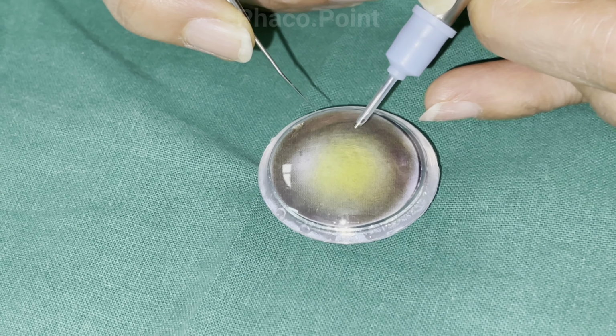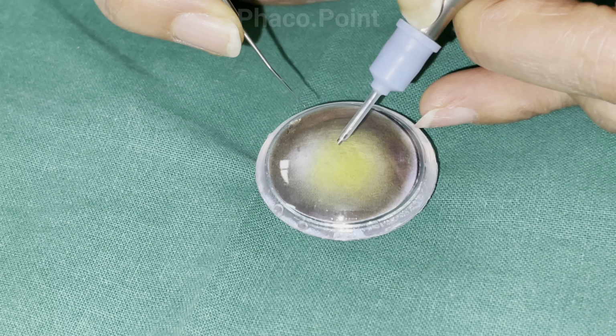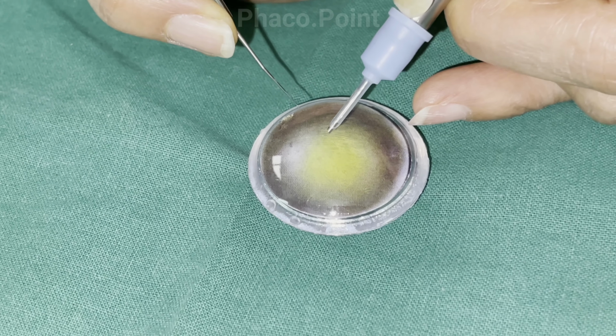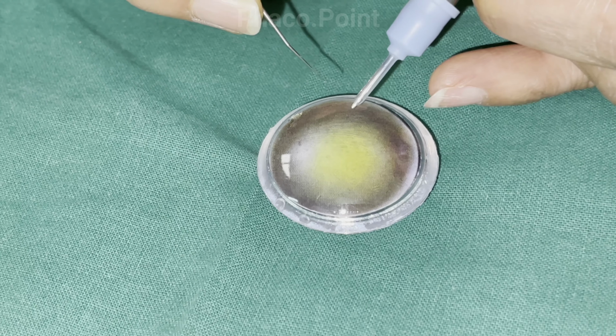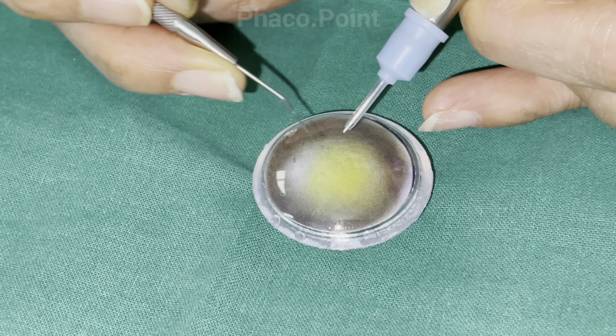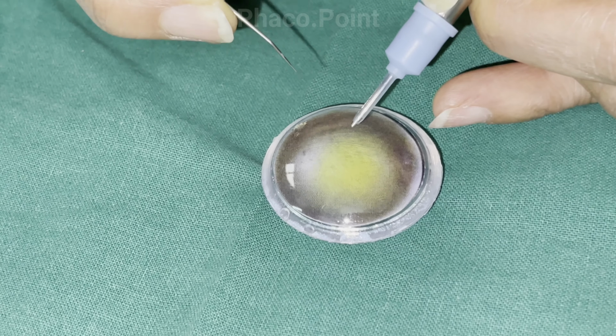When the phaco starts, I bury and engage into the fragment. Once I've engaged into the fragment, I lift it up in foot pedal 2 to confirm its fixity. I bring it up in foot pedal 2 to the safe zone of the pupil, back to 3 to emulsify it, and as soon as the last bit of the fragment goes in, foot pedal 1.